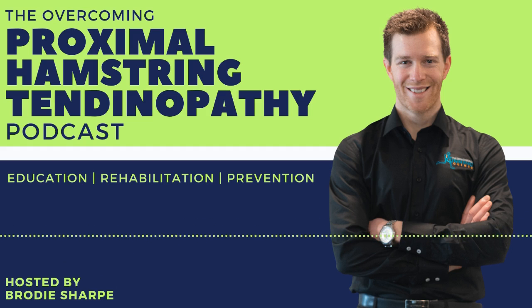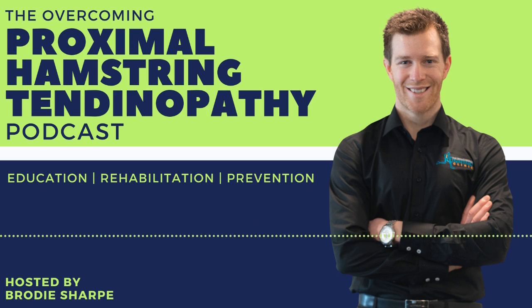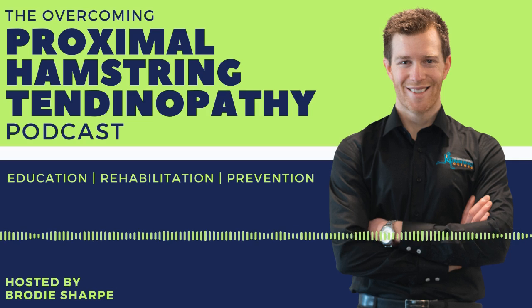So the way I give Shockwave to my patients, the way I say it to them is 3 plus 12. What I mean by that is 3 weeks, you give once a week. So 3 weeks of Shockwave plus 12 weeks of rehab. And if you're not happy with that, then I would suggest not to do it. So it's never 3 plus 0. It's always 3 plus 12. So 3 or 5 weeks of Shockwave plus 12 weeks of graded loading program. And that could be one of the main reasons why I get great results.